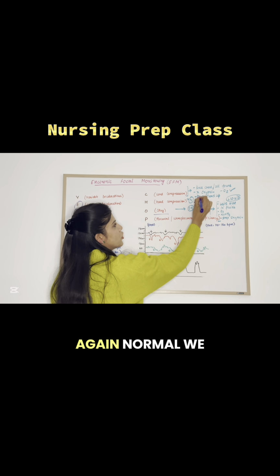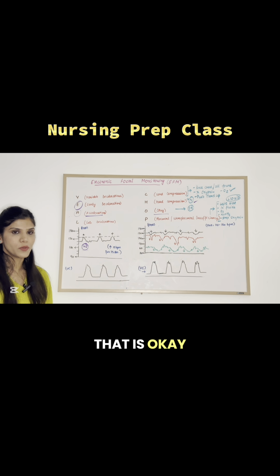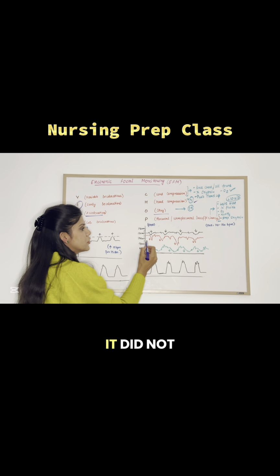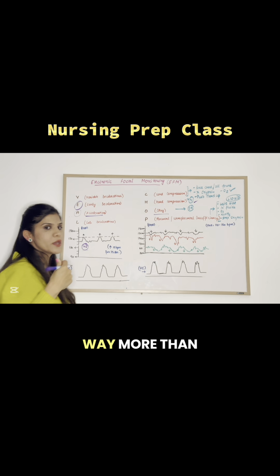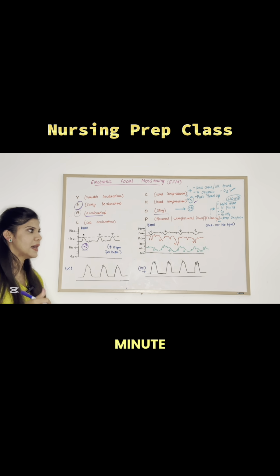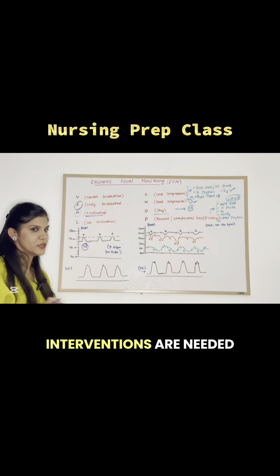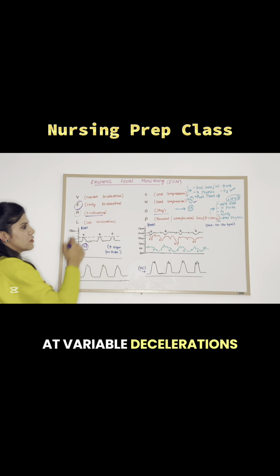And that is again normal. We don't have to do anything with that. No interventions are needed. That is okay as long as the heart rate does not go to less than 100 beats per minute. So if you see over here, it did not fall to this range below 120. It stayed somewhere right here. So it was way more than 100 beats per minute, and it did not fall below 100 beats per minute, and the baby was able to pick up the heart rate and it got back to the baseline. So as long as it is like that, we are fine with it.